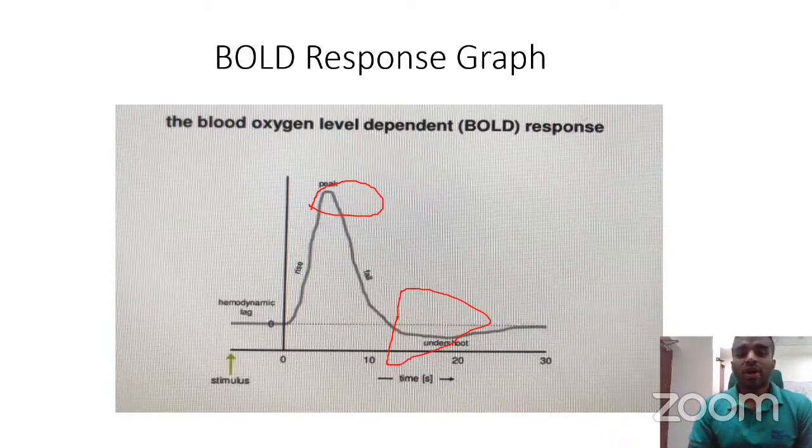So in practice, we ask the patient to do an activity. For example, the patient would be tapping his finger, so the graph goes up because of the high amount of perfusion of oxygenated blood to that particular region. Then after some 10 to 20 dynamic scans, we ask the patient to relax. When the patient relaxes, blood flow to that region stops, since the patient has stopped that activity, so the graph comes back.